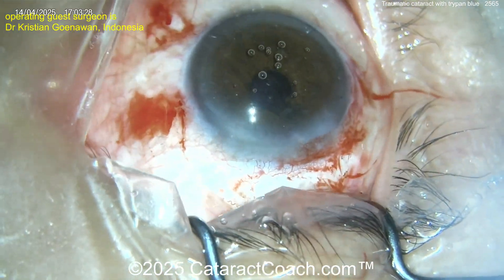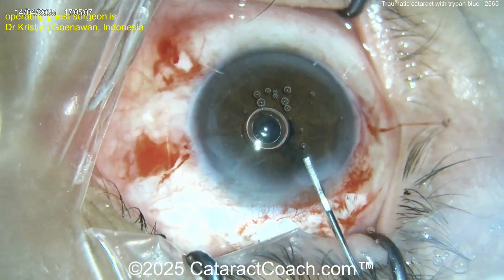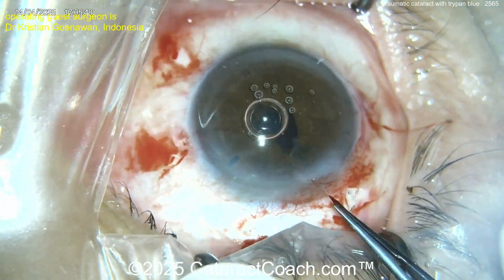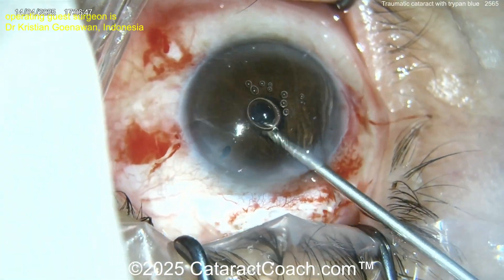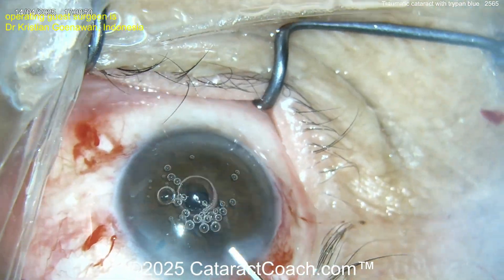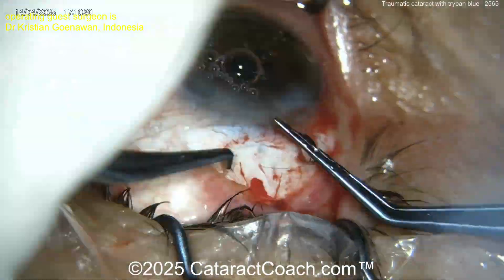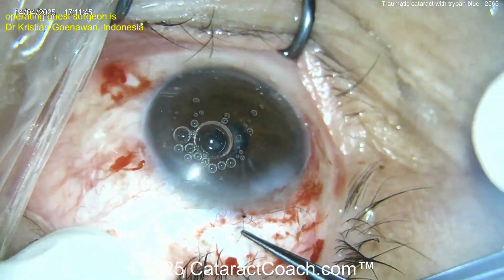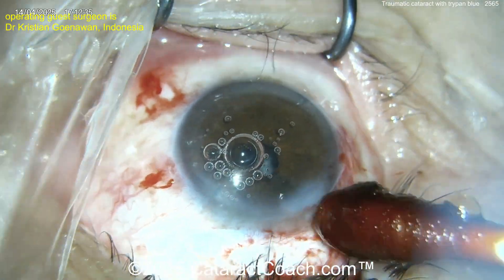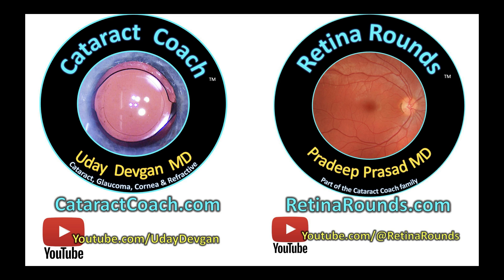Getting the other clip onto the iris — this patient is going to have a really nice outcome. More triamcinolone, and I like the pupil brought down with Miochol or Miostat. Finishing up the case — I'd put a suture here for security; it would let me sleep better at night. This patient is going to have a beautiful outcome. Take-home lesson: if the case doesn't go as planned, you can wrap it up and come back a month later. Check out retinarounds.com — you're going to love it.